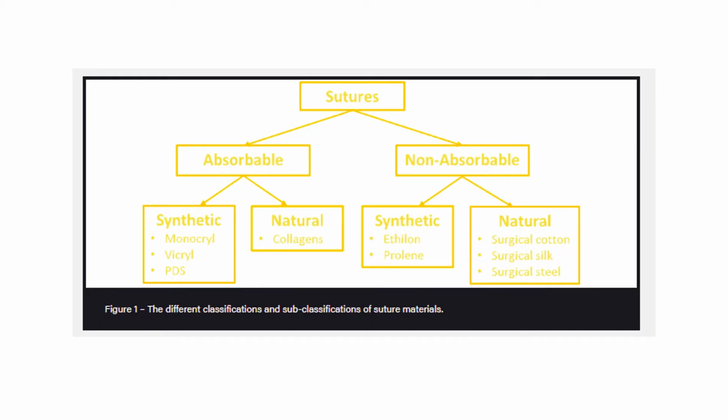So this is just to show the classification of suture material. We can have absorbable, non-absorbable. Absorbable can be classified into synthetic or natural. Non-absorbable can be classified also into synthetic or natural.